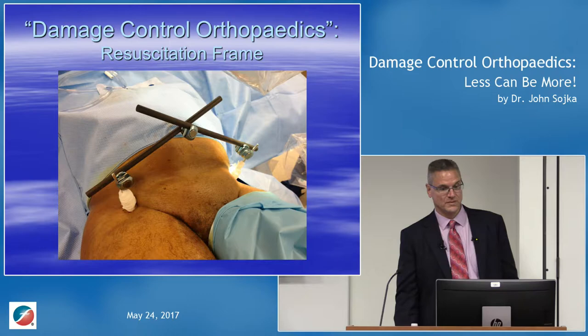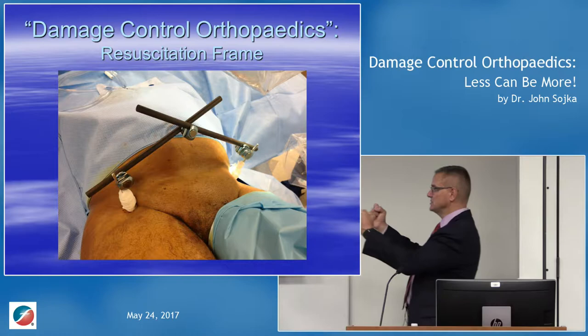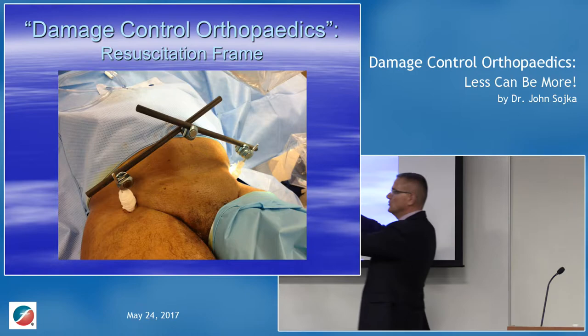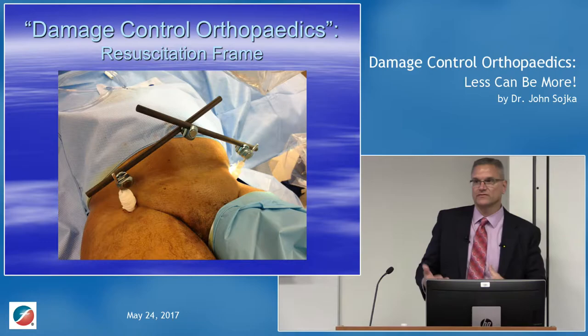So here's his single pin X-fix. I run those anterior to posterior right at the AIIS, or the anterior inferior iliac spine. Gives me great control. I just use those as joysticks. I close his pelvic ring down, attach those bars to it while I'm holding it, have the residents or one of my partners tighten that thing down. And now you've got his pelvic volume closed down, and we did that in the time that I just gave this first part of the talk, so 10 minutes, right?